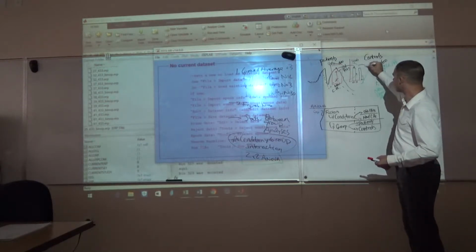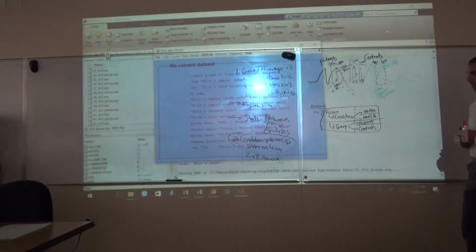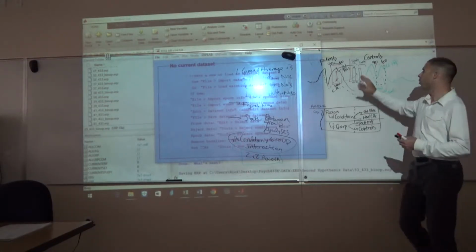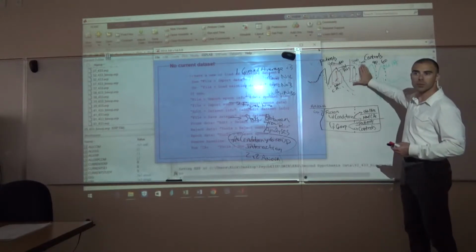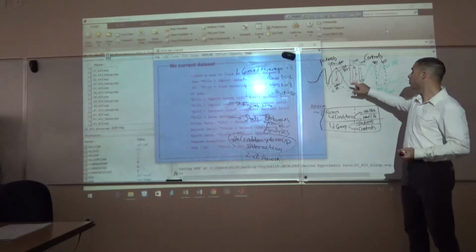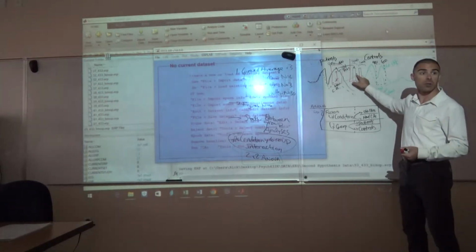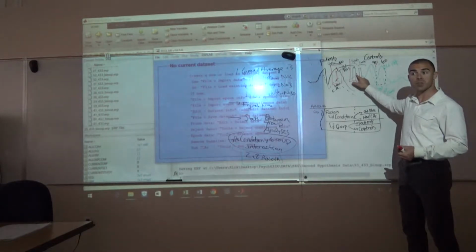So this would be of your controls. Okay, this would be correct rejections. Now, so far we've only done one group, right? We've just looked at controls. And we would run a t-test between this versus that to see if it's significantly different, right? Every person in class has done this. You guys understand?